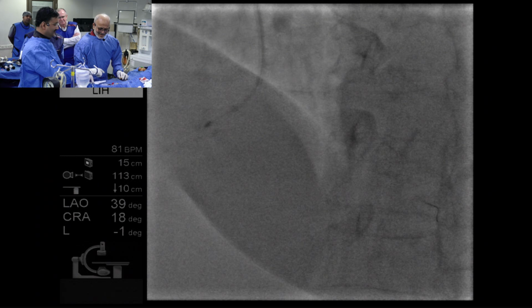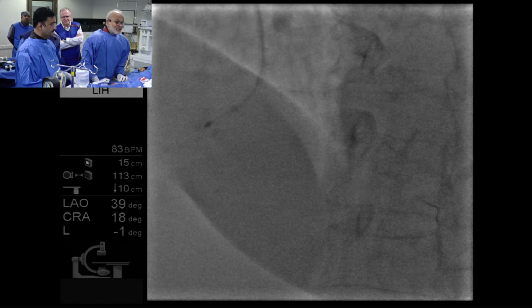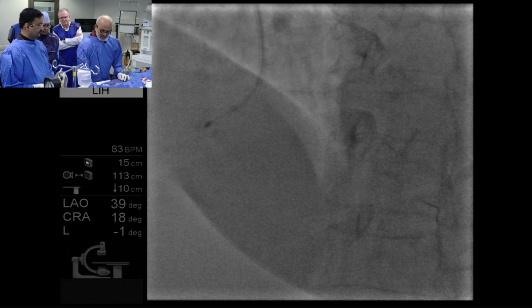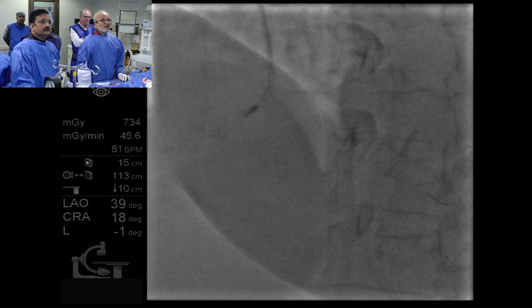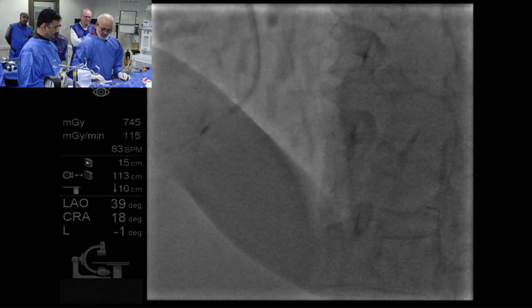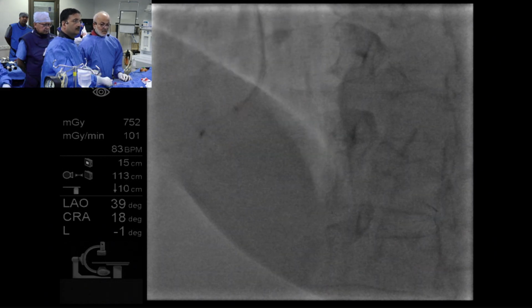Okay, now Dynaglide off. I'm holding. Push it. We don't hurry. This is too perfect.